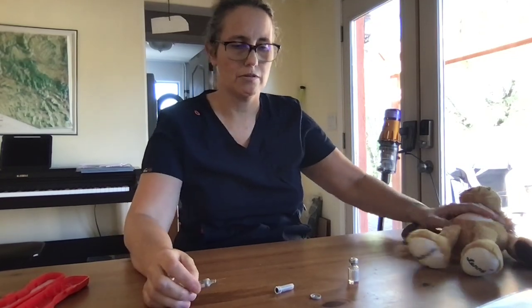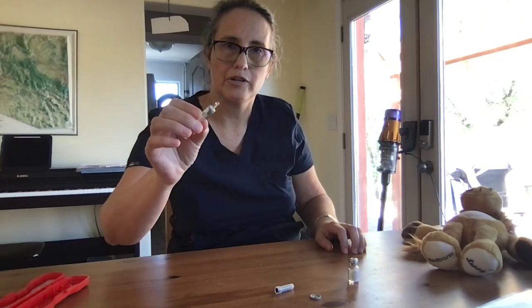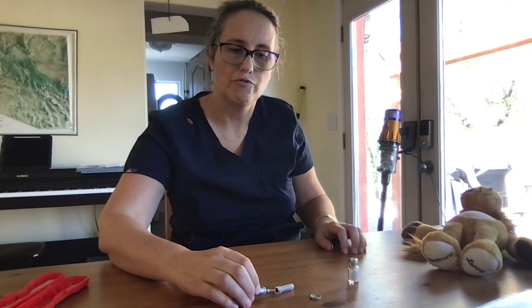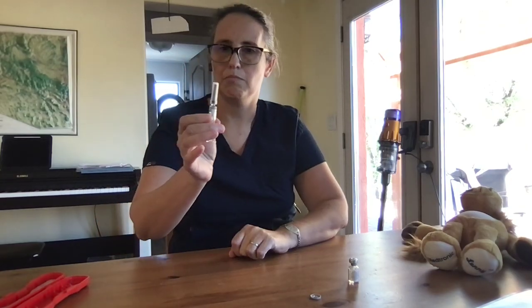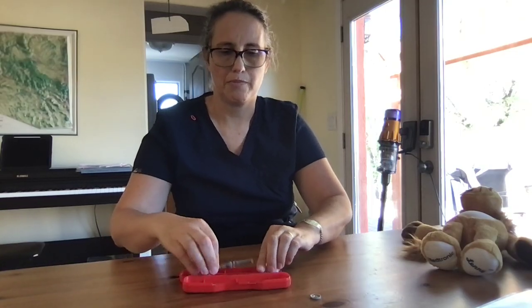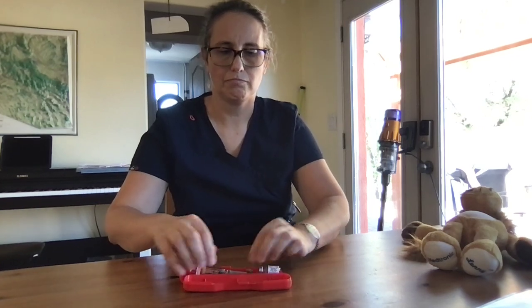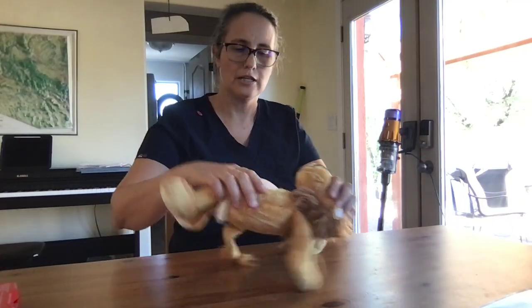To recap the needle, we're going to do the one-hand scoop technique. I'm going to take the needle, fish for the opening in that needle cap, and then help by putting the cover back on. I'm going to put that back into the glucagon case, put my materials back in there. Hand that to someone, and write the time we just gave that on the box.